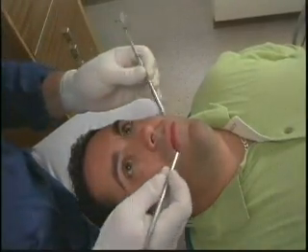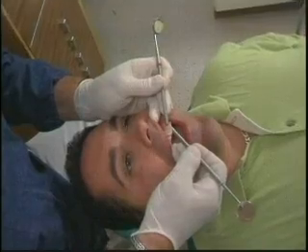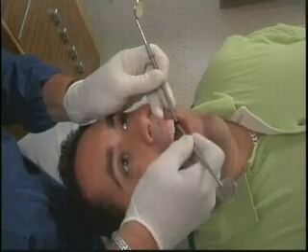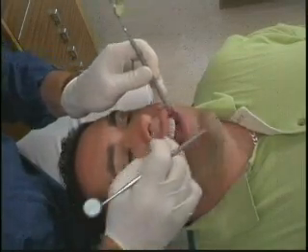After we've done the oral cancer exam is to check the teeth for mobility. So we do that with two mirror handles, and we just sort of basically push back and forth like this. I like to get a feel for whether the teeth are tight or loose before I even go any further, just so I have an idea of what we're working with here.